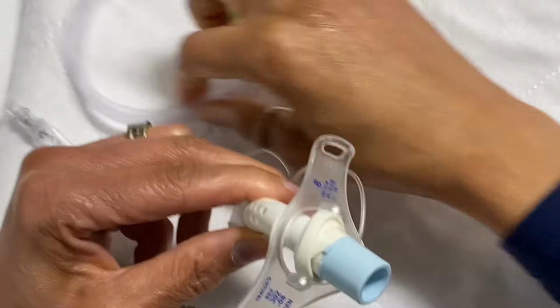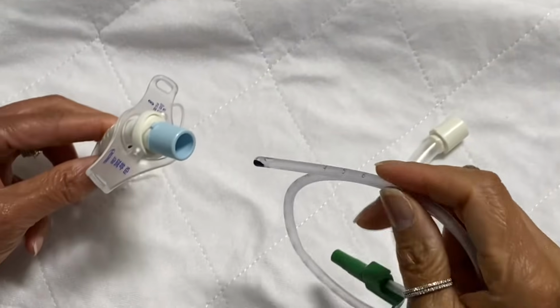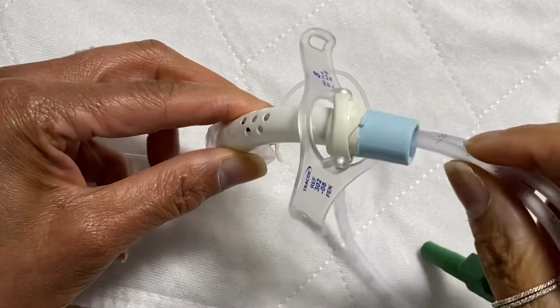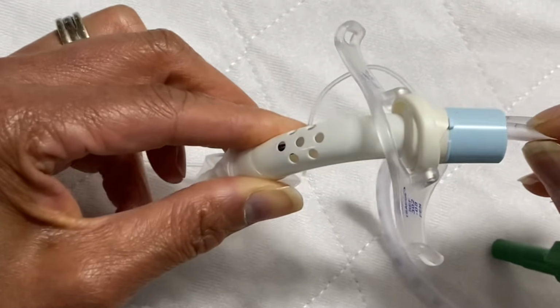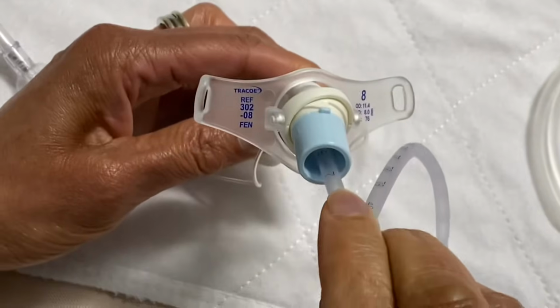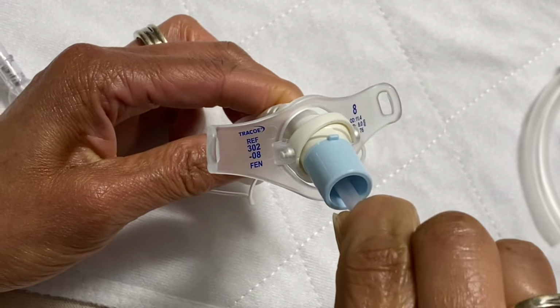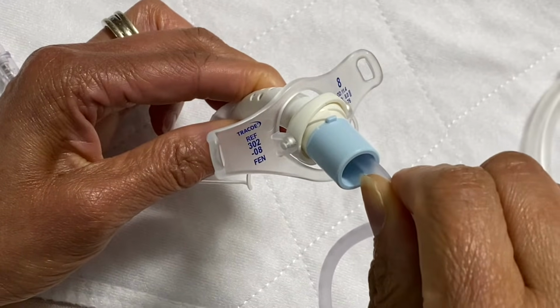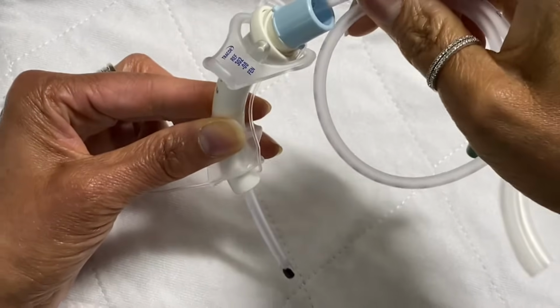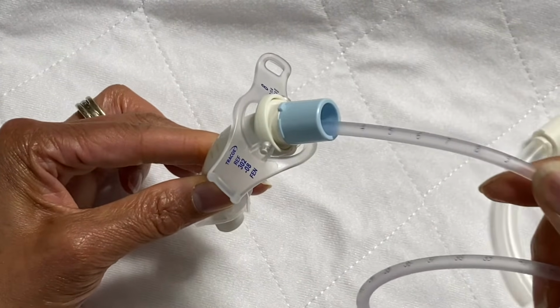We know that you've been having difficulty feeding the catheter through the trach when you want to suction your patient. So once you put your catheter inside the inner cannula, you're meeting some resistance here. So what's happening is you're bumping up to the opening on the inside of the inner cannula. So to get past that resistance, you just turn your catheter just slightly, and then the catheter will flow down through the end of the trach. And then you suction and you just remove it.